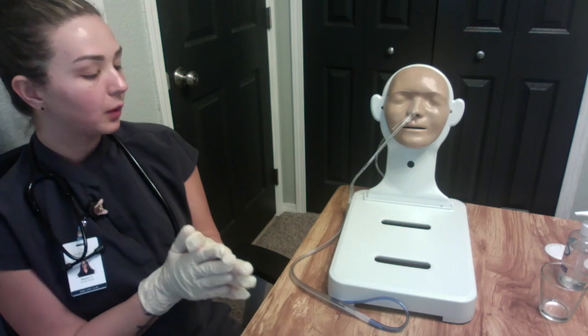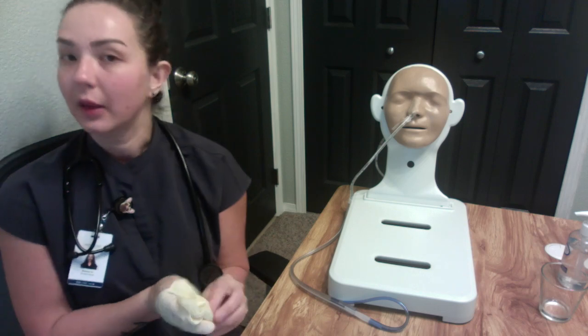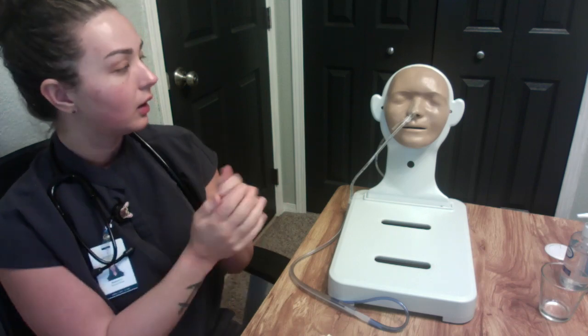Okay, and then we would want to remove our gloves, ask the patient if they were doing okay, and then after the procedure, we would definitely want to document the procedure, how it was tolerated, and the patient's response. So we would want to document the assessment date.